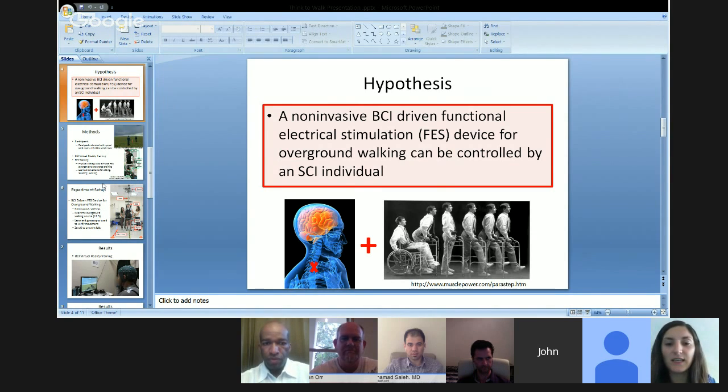And what it does is it electrically stimulates your gluteal muscles, your thighs, as well as your tibialis anterior, or your shins, to allow you to perform the cyclic-like motions of walking. As well, it can allow you to sit, stand, and walk, all while using the Parastep system through the FES and using manual control switches that are mounted on the walker.